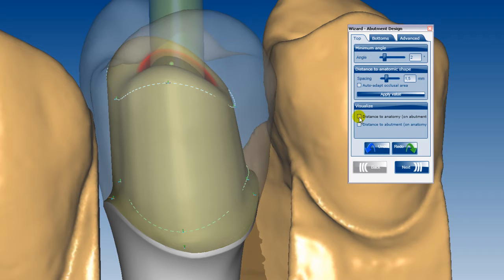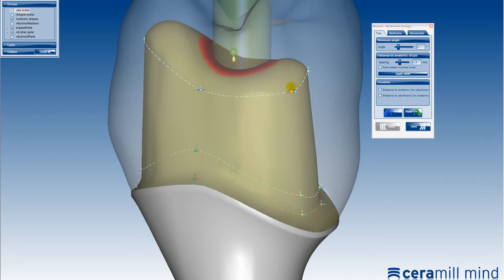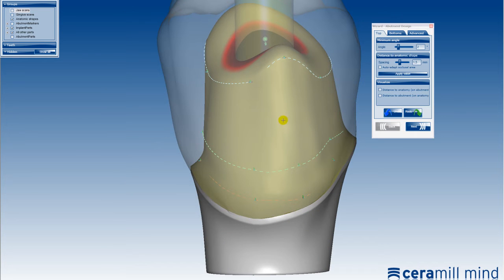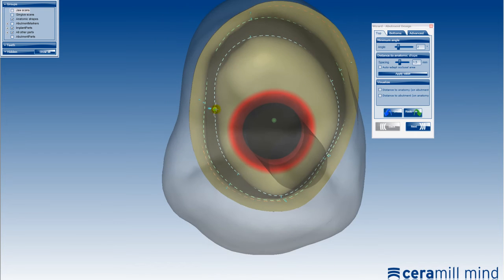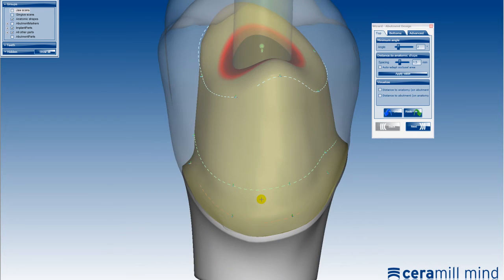The shape of the abutment can be individualised using the control points shown on the abutment surface. Overlapping points always move interdependently. Points can also be added on each line by activating the control key and a simultaneous left click.